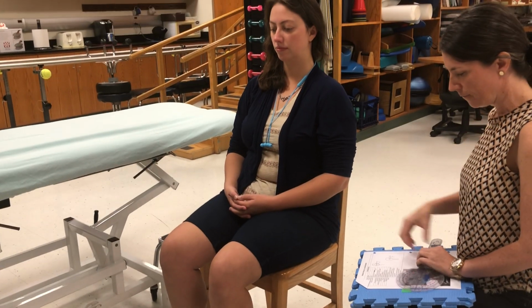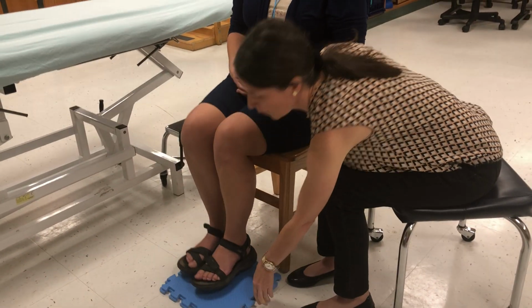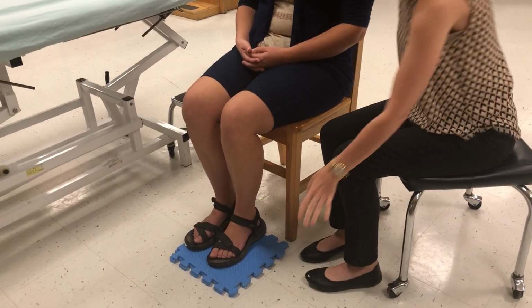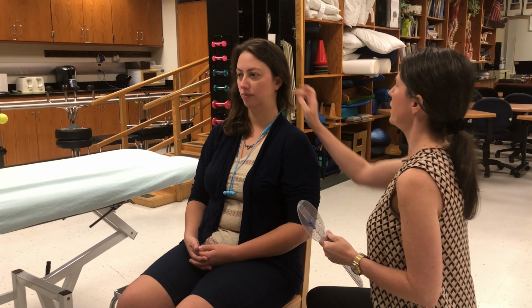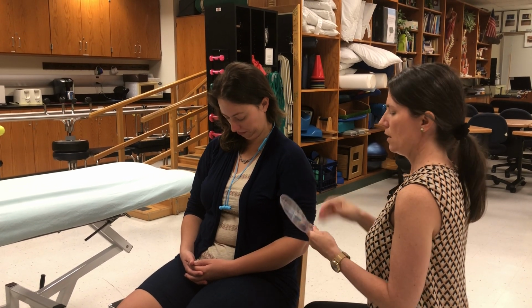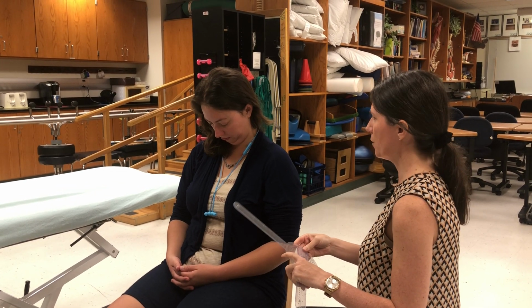And as you can see, the standard position for the patient is sitting in a wooden chair, back fully supported, feet supported. If the feet are not supported, you would put a little foam square or 2 or 3, however many is needed, underneath the feet to make sure that the feet are supported, but yours are, so we don't have to worry about that. So the instructions are, can you please look straight ahead, and can you please bring your chin to your chest? So we don't say, can you flex your cervical spine? We need to use layman's terminology.